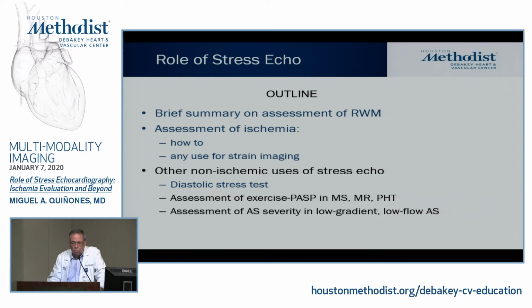And of course, I'm not going to talk about it, but you all know, from previous talks we have done, that we can use exercise stress to assess pulmonary pressures in patients with mitral valve disease, people who have mild to moderate pulmonary hypertension, and of course, we use dobutamine in aortic stenosis.